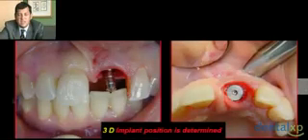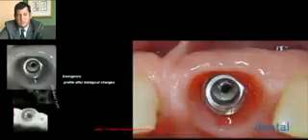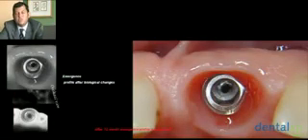In these cases, after 6 months using the natural tooth, we see that we can keep the emergence profile. We are trying to fix the position of the tooth with the jig, so after we place the implant in position, we can replace the natural crown exactly how it was before, so we are not pushing the soft tissue forward or to the palatal.